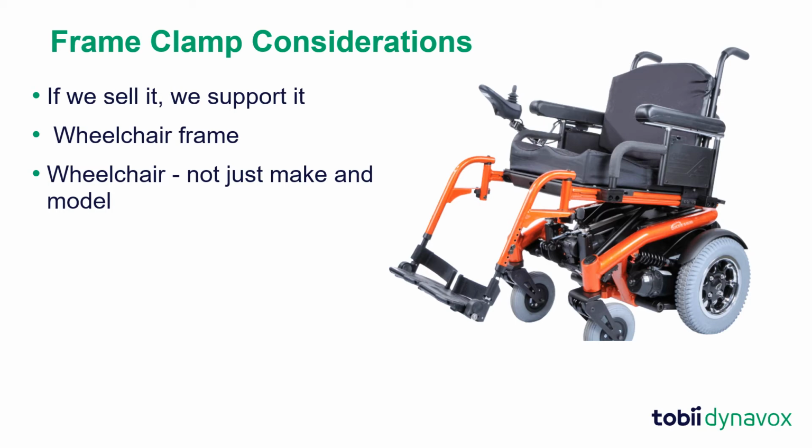However, seating options and tie downs can be added for the user after the wheelchair is ordered, which can impact the type of frame clamp you need to order. Remember, these types of wheelchair components can change the configuration of the available space.